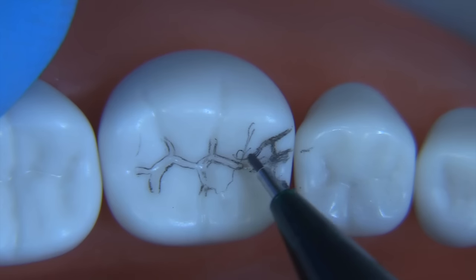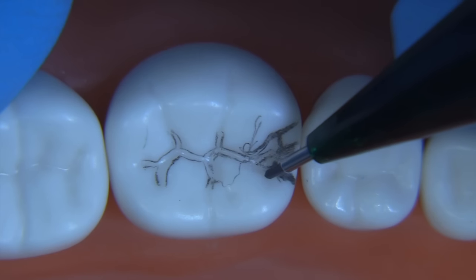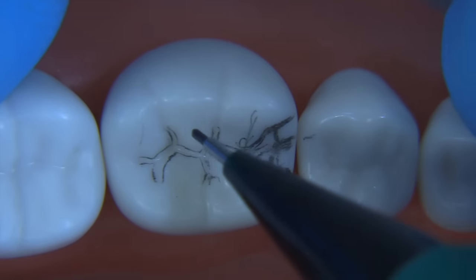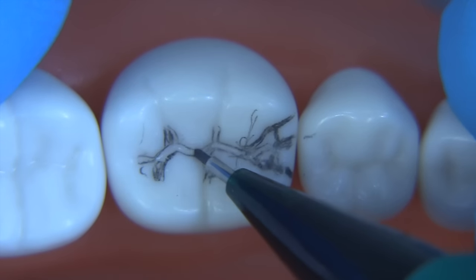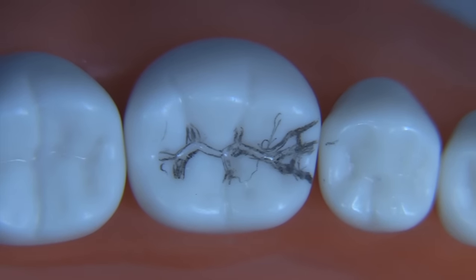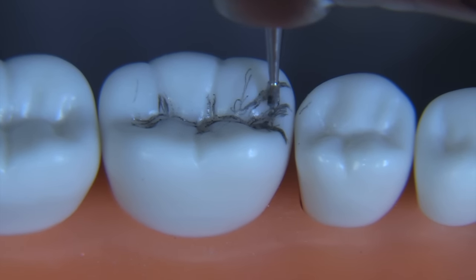You can also draw in the s-curves. We'll talk about s-curves a little later in the video — exactly how I approach them and how they can be made more easily. You can see the s-curve will curve around the triangular ridge on the mesial buccal and blend into the box, where the box itself is not going to change its shape as a result of the s-curve. The preparation is going to be started utilizing a 330 bur and we'll follow these primary grooves moving from mesial to distal, omitting that little tail moving off towards the distal lingual.